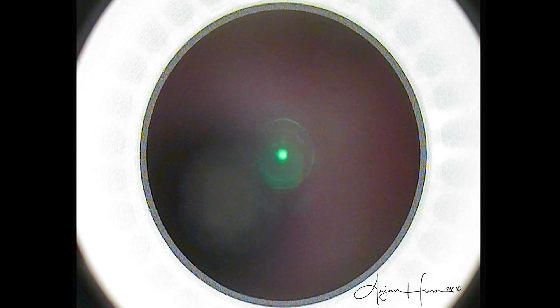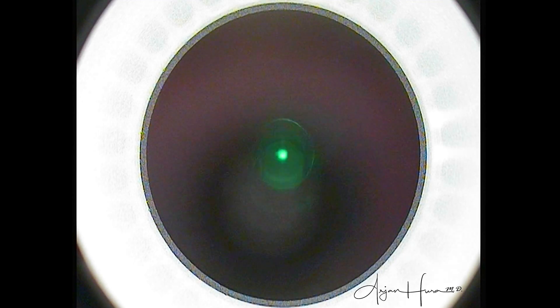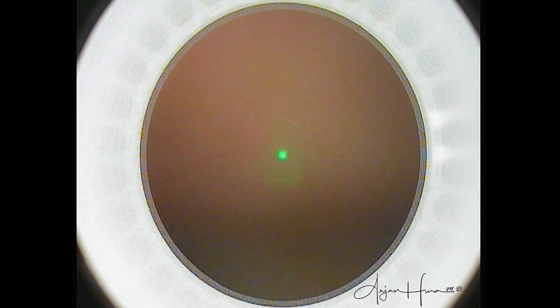In this SMILE case, the patient has already had their eyes cleaned and prepped, and is now underneath the Visamax laser. We see the laser head about to dock on the cornea, and what I'm not showing you is that I've already confirmed the patient's visual axis in both eyes before starting the procedure.